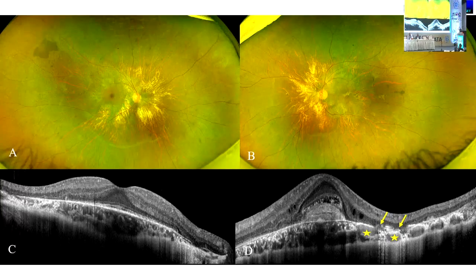Just beyond that, you see RPE atrophy, which is probably what you're seeing there also. Yes. So I would probably revisit the diagnosis of choroideremia in this patient. Okay. But then the CNVM, there's no other way. CNVM can happen in any of the other hereditary macular degenerations as well. That can be, but I'm not sure if this is choroideremia. Okay. That too, I will redo the tests. I've advised him, but once he comes back, maybe the electrophysiology and fields at least.